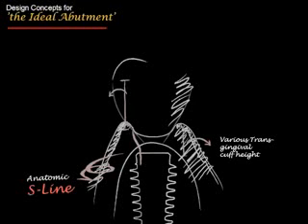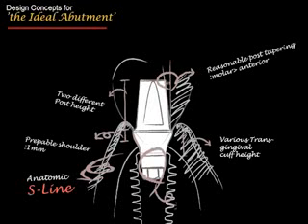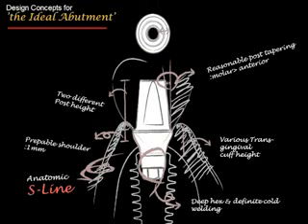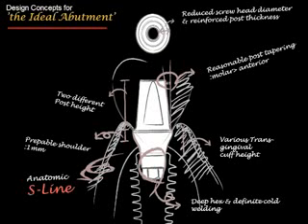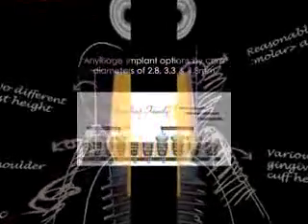Let's look at the prosthetics quickly. The S-line prosthetic is very unique because you have an extreme platform switched scenario, but you have a very strong connection. It is a 5-degree Morse taper with, again, an internal hex, so you feel it very, very nicely when the abutment goes into place. But again, with that 5-degree Morse taper, the connection is very, very strong.